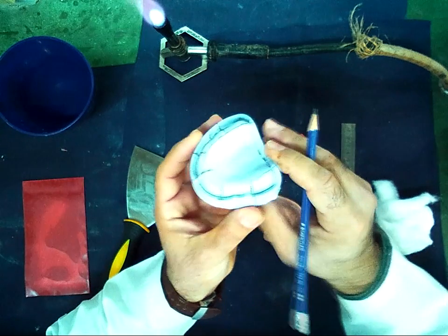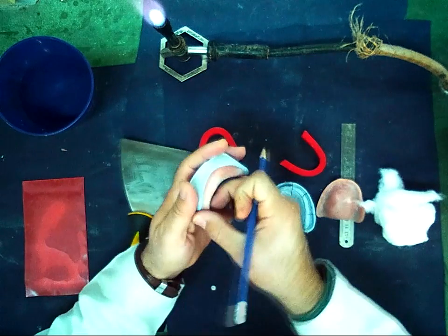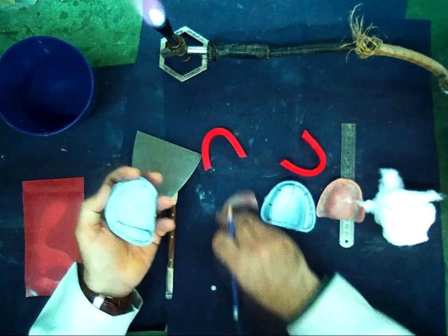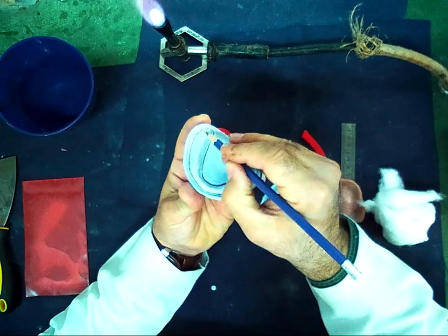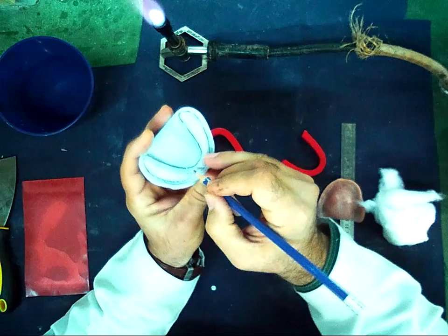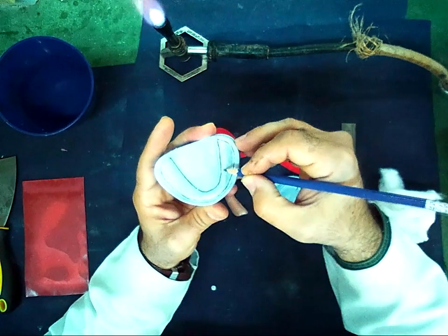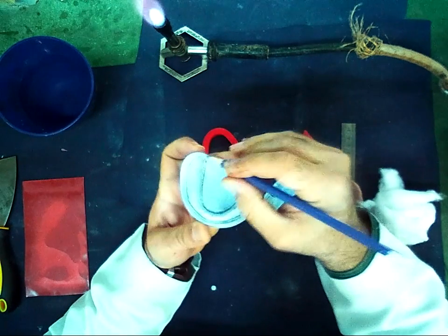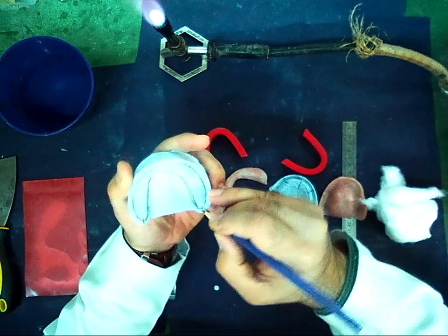This is for the upper. For the lower, the same, I draw a line on the crest of the alveolar ridge, and to the posterior part of the cast.